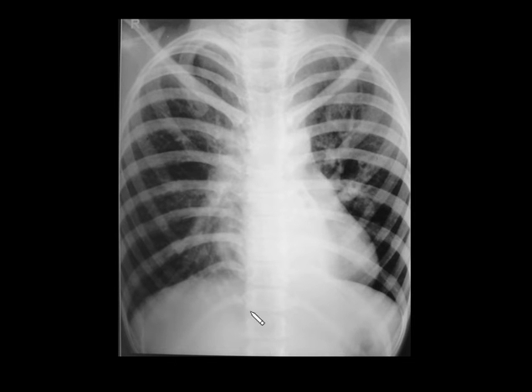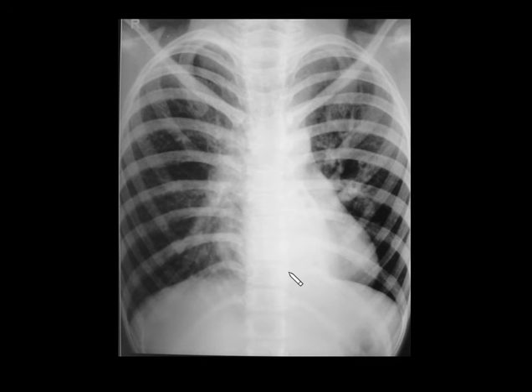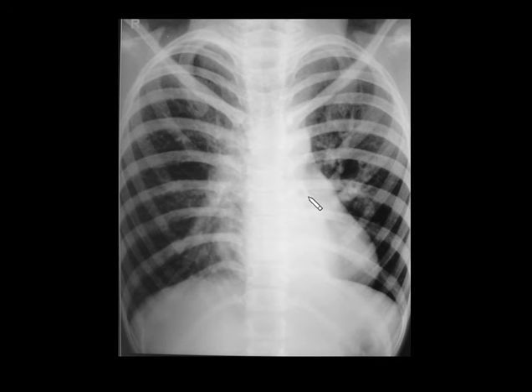Coming to the next spotter, you can see a retrocardiac density causing silhouetting of the medial half of the diaphragm but not causing silhouetting of the heart border. This is a retrocardiac density, classical of left lower lobe collapse.